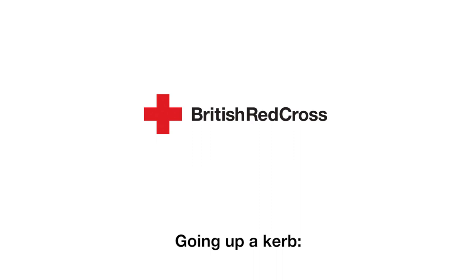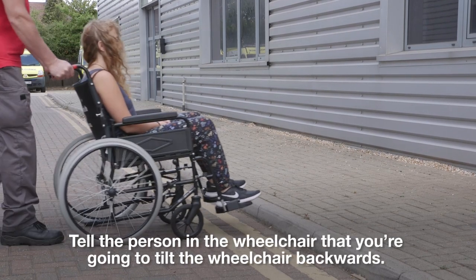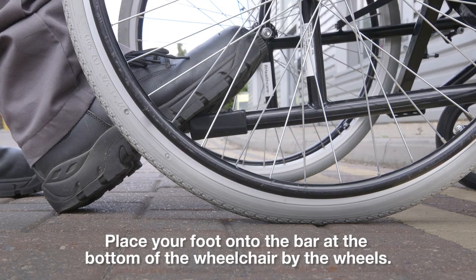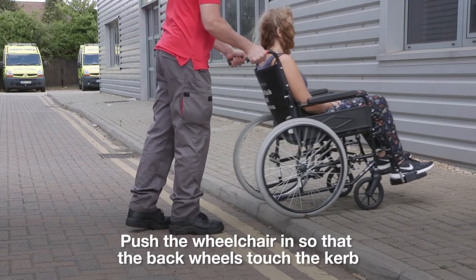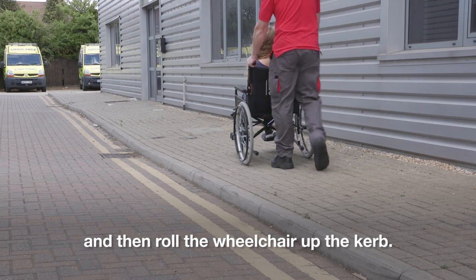Step 5, going up a kerb. Push the front wheels into the kerb. Tell the person in the wheelchair that you are going to tilt the wheelchair backwards. Place your foot onto the bar at the bottom of the wheelchair by the wheels. Use the bar to help tip the wheelchair back with your foot. Push the wheelchair in so that the back wheels touch the kerb and then roll the wheelchair up the kerb.